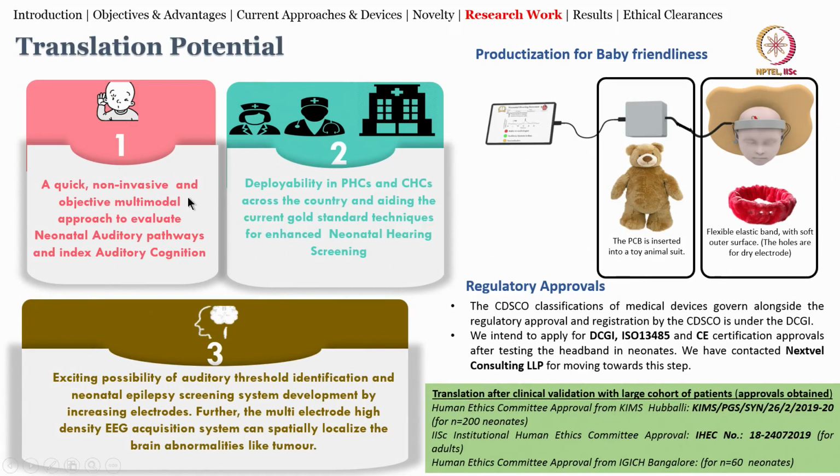So, if you look at the translation side of this particular work, it is a quick, non-invasive and objective multimodal approach to evaluate neonatal auditory pathways and index auditory cognition. There is deployment in PHCs, which are primary health centers, and CHCs across the country, aiding the current gold standard. Right, we are not removing anything, you do understand this.